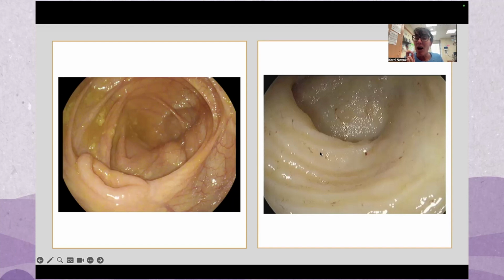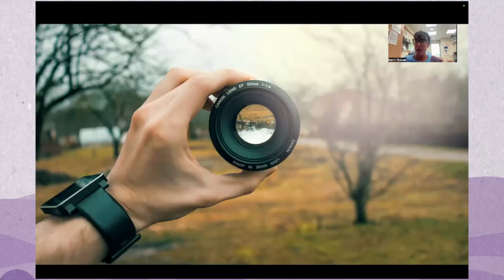You can see the tiny little villi if you stare very closely. Those villi are finger-like projections, and they're the workhorse of nutrition. This is where our nutrients are absorbed in the small bowel. This is also where Crohn's disease occurs. So colonoscopy is a very useful test. Sometimes we do gastroscopy too, in order to look inside the bowel.